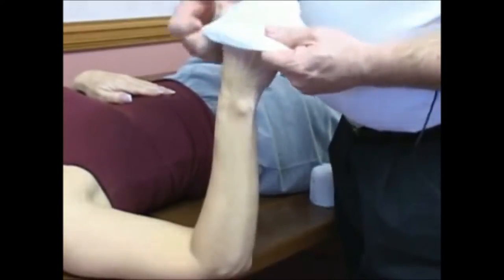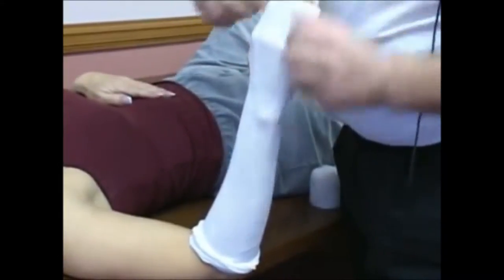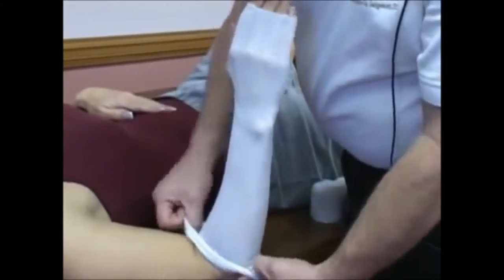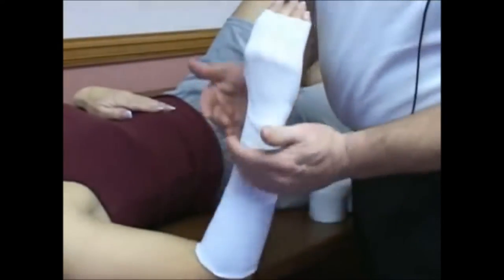Slide it over to your hand. Now I have all this to fold back. If I had cut it up here, you have less to fold back. At the end of the arm, I like to do a double fold so you have a little extra padding down here.